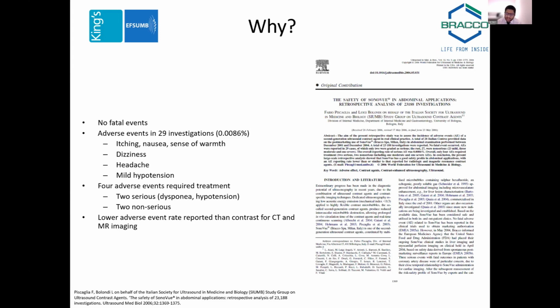And that's much lower than the adverse reaction rate you see with CT or MR. But yet we don't bat an eyelid about the idea of giving CT or MR contrast to patients. So therefore, why should we think about it so much with ultrasound contrast? The truth is, it's just a matter of exposure and learning and development with it, and then we'll see quite how safe it is.